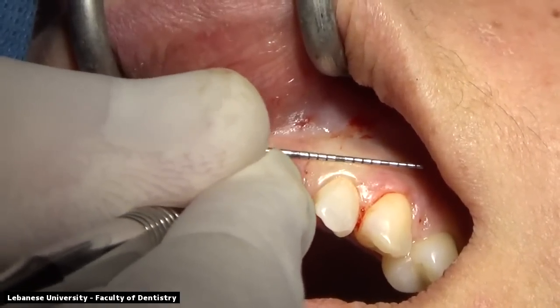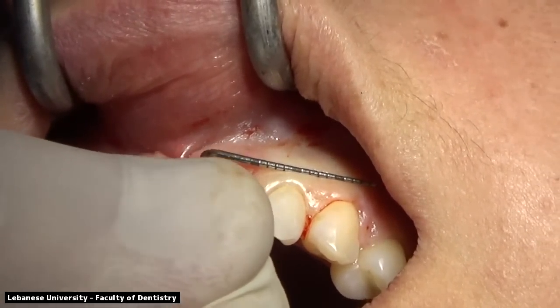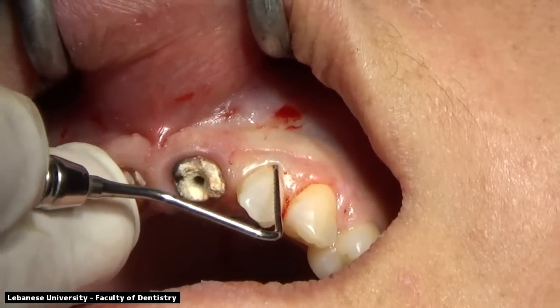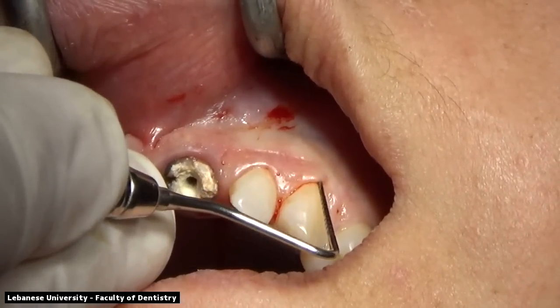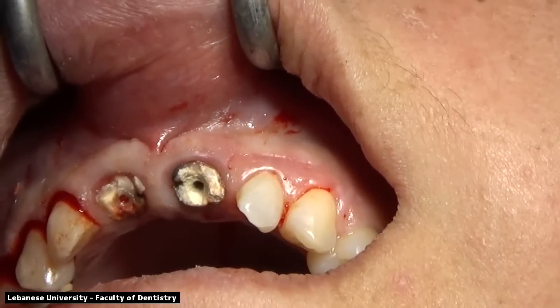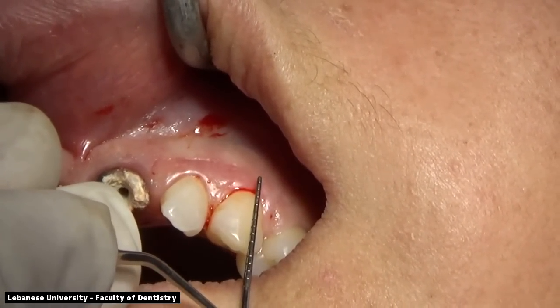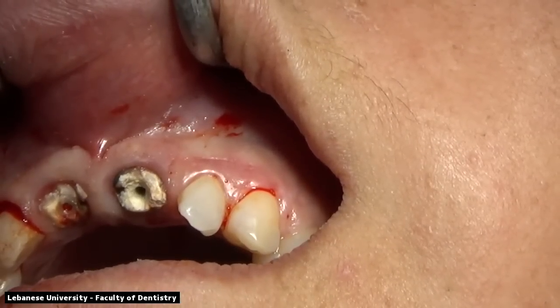Going to the next side, we're going to do the same measurements, which are the gingival level measurements according to the central incisor, then going into the bone sounding again, creating our bleeding points. So we have about 2 millimeters of supragingival tissue, so the SGT in this case is about 2 millimeters.